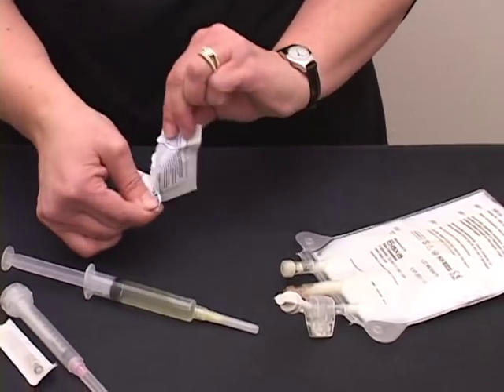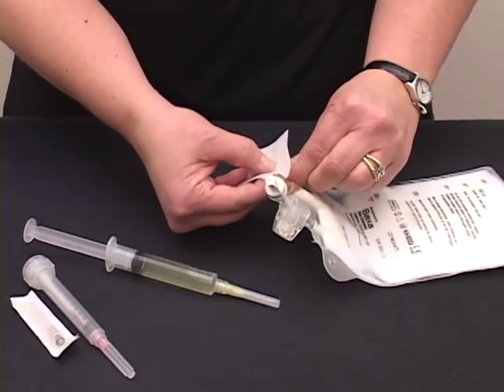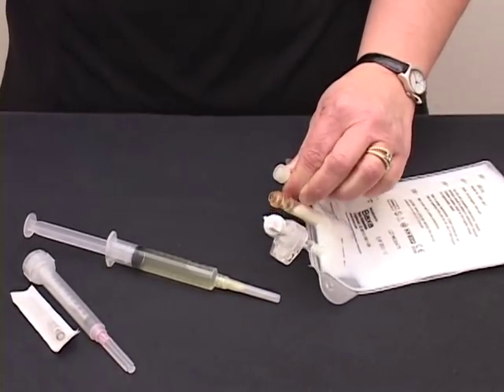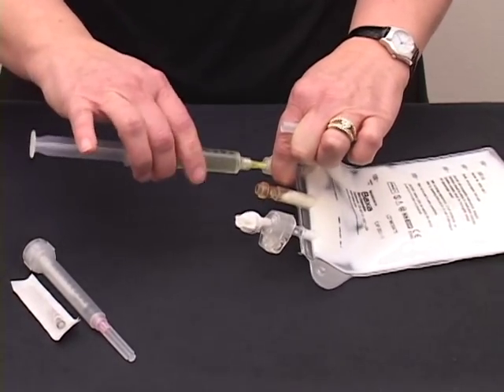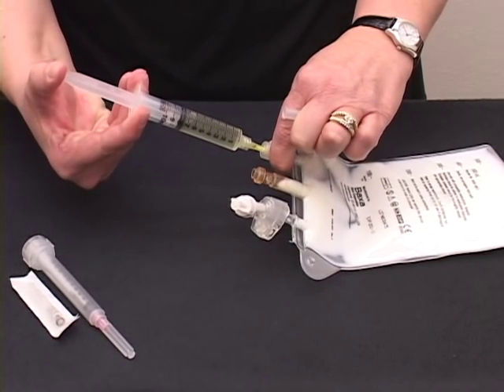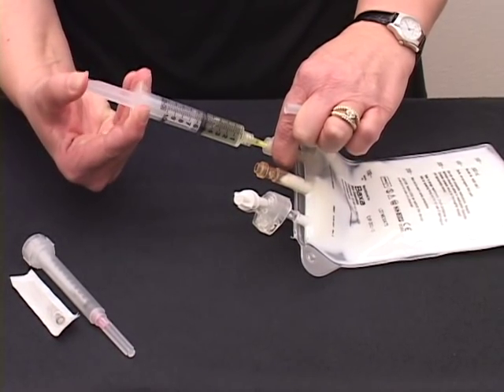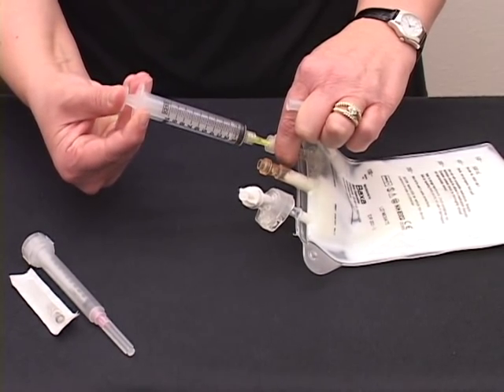Take an alcohol swab, scrub off your injection port, remove the cap from your needle, stick it into your injection port and slowly inject the fluid into your bag. Once it all has been injected, pull out your needle.